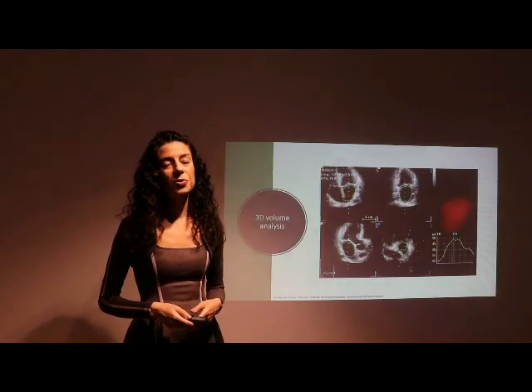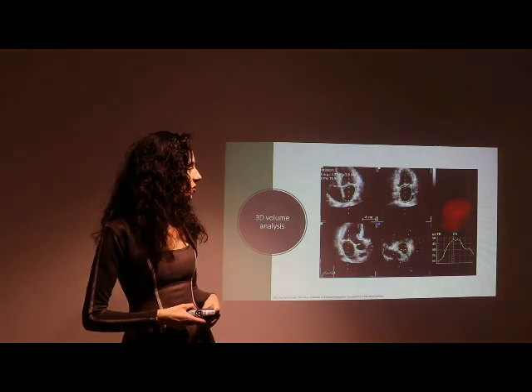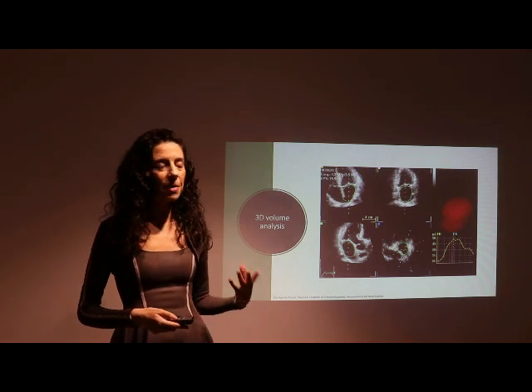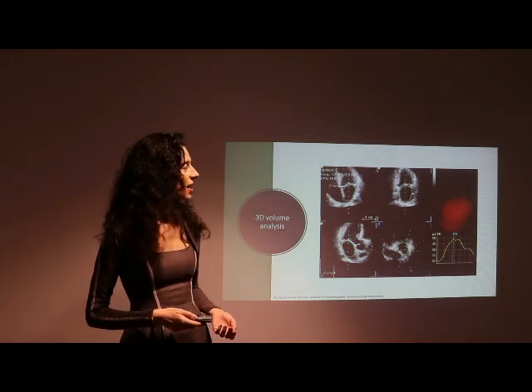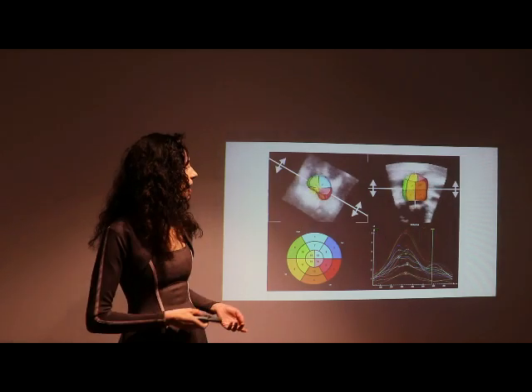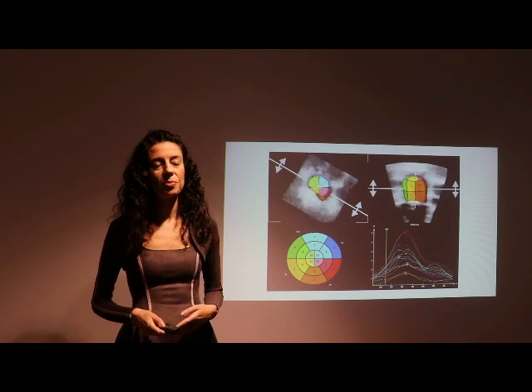Another useful way to measure the volumes of the left atrium is to use 3D echocardiography. Here we could measure very easily all the useful volumes of the left atrium, and also we could measure the segmental volumes of the left atrium.